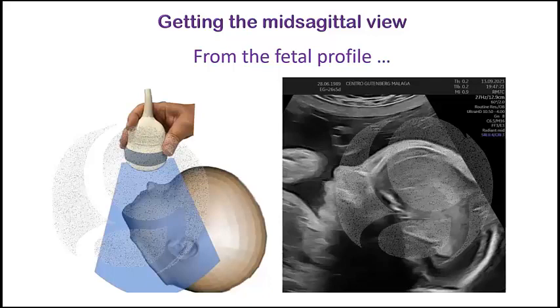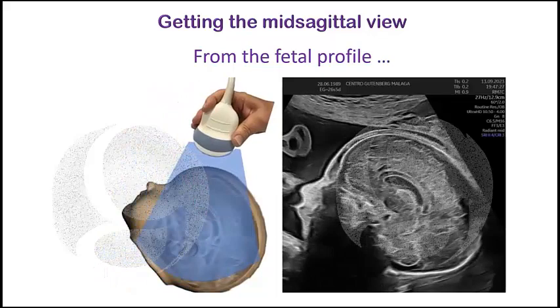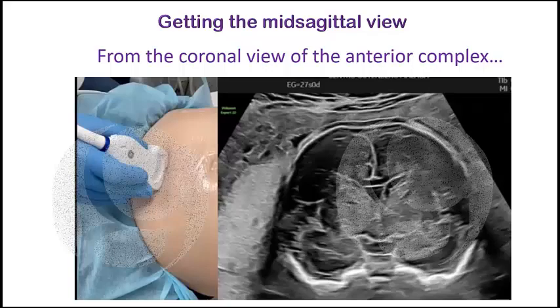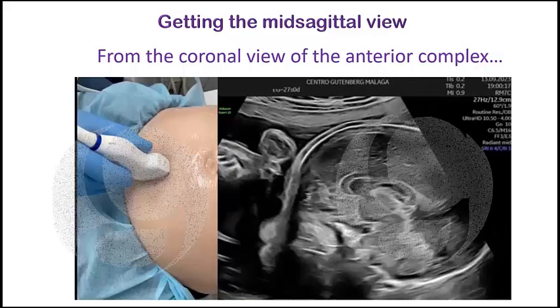All of you know how to get a nice image of the fetal profile. When you are looking at the profile, you only need to move slightly the probe following the frontal contour until you insonate through the anterior fontanel. If you are in the coronal view, you only need to twist the probe 90 degrees while you keep looking at the corpus callosum to immediately get the sagittal view of it.